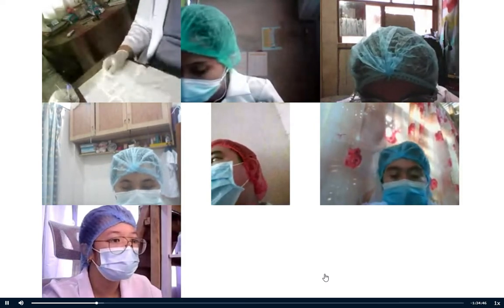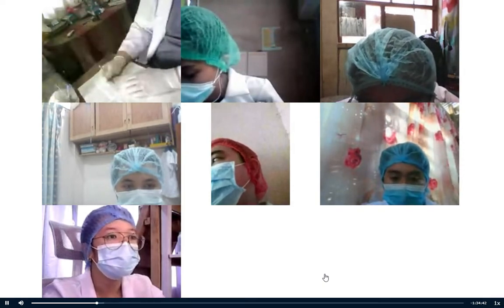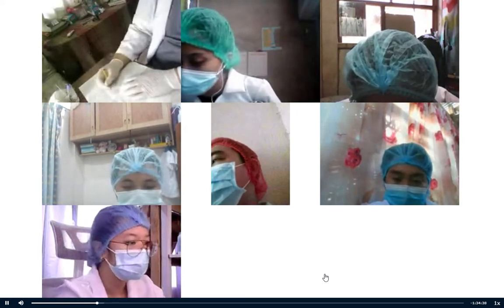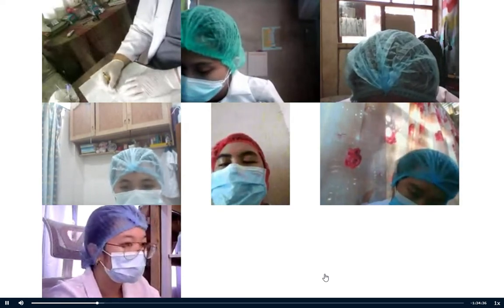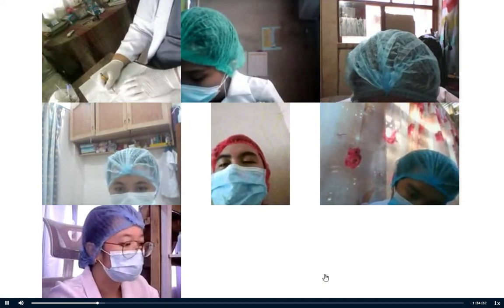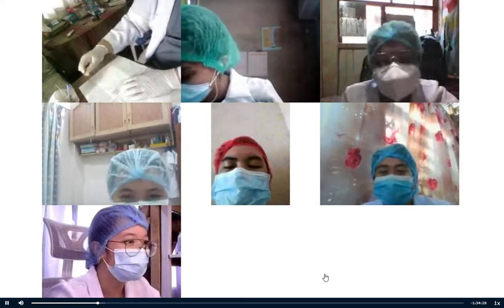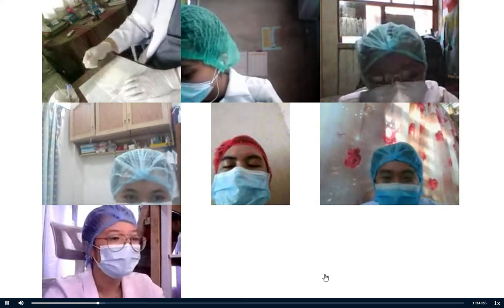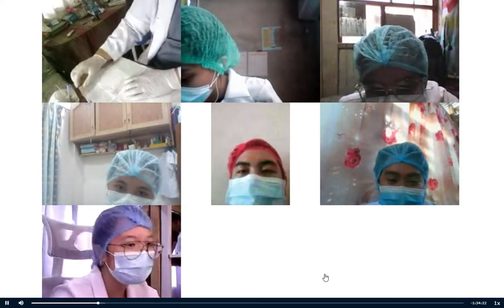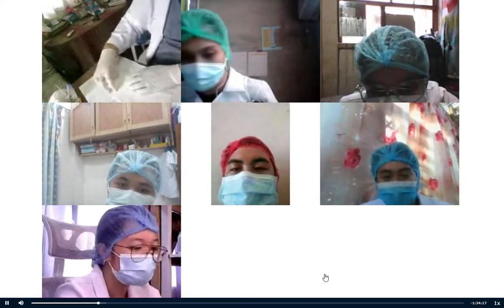So the first thing you need to do is to label your specimen. So let's say the name of the patient is Miss Adrian Ilisan. So the name of the patient is Adrian Ilisan. So you label it the full name. You may even start it with the last name followed by the first name. Now, after you've labeled that, class, you have to now prepare your smear.